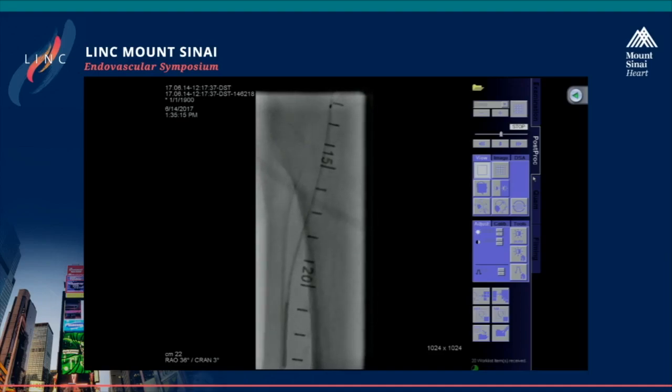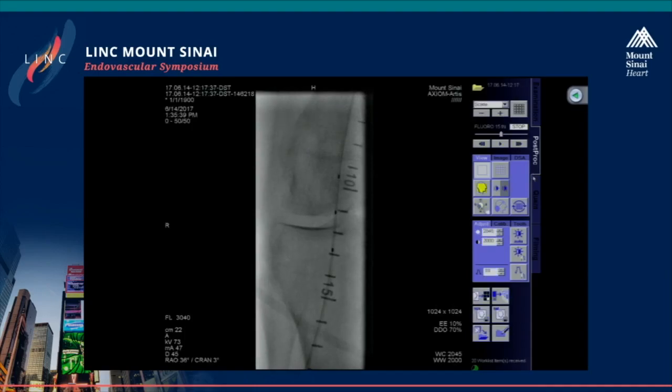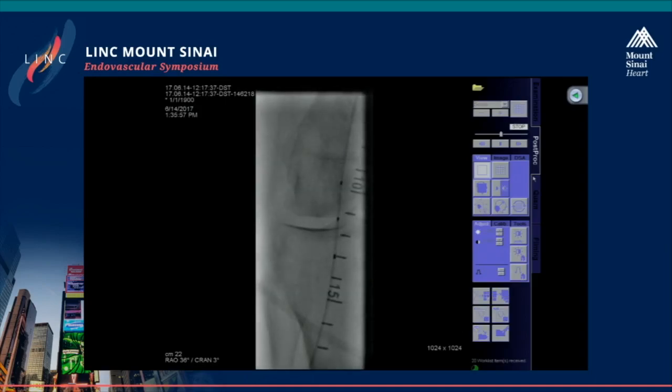Okay. So why don't you walk that out now, Karthik? And then what we can do is, why don't you just get the external length of wire? Just keep pushing. No, you have to walk that out. Well, now what we're going to do is walk out the Trailblazer and just push the wire. Walk the Trailblazer out, guys. And then just keep pushing the wire.